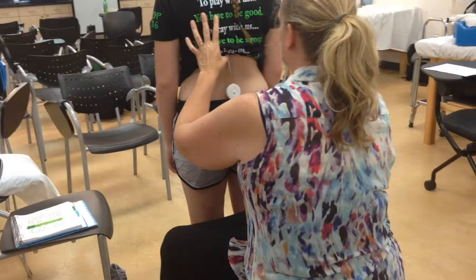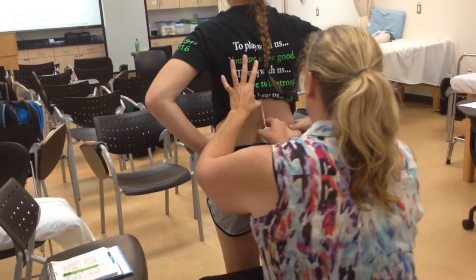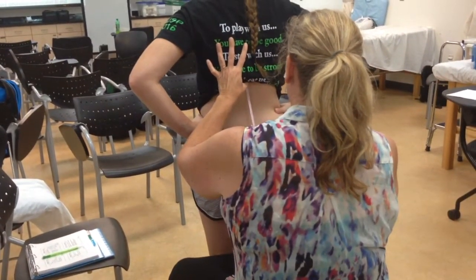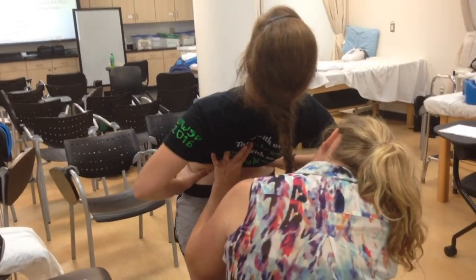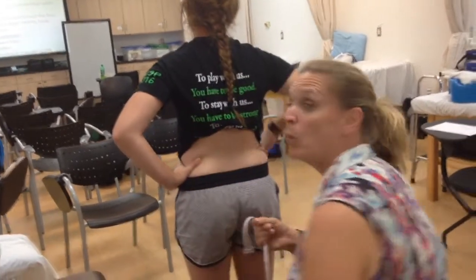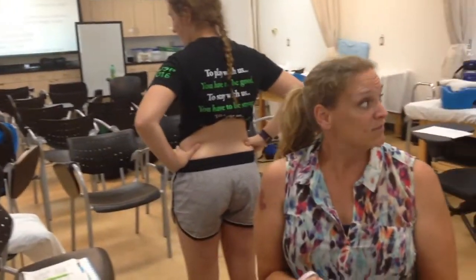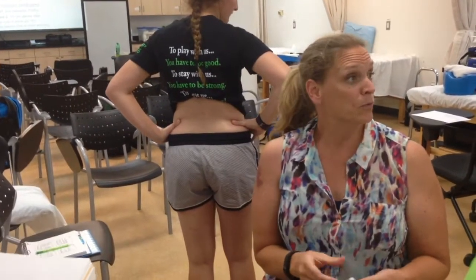What's the name of this? Hands on your hips — I'd like you to lead with your head and arch your back backwards as far as you can. Okay, and come on back up. That was 10.8. So what I'm going to document is 15 minus 10.8, so that should be 4.2.